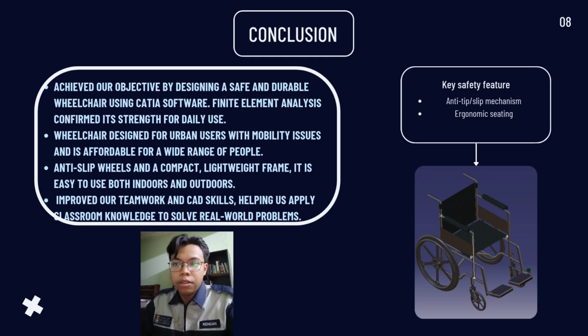So I will talk more on the conclusion of our project and also the overview of all of our drawings and the parts themselves, the assembly. So in conclusion, we have successfully achieved our objective by designing a safe and durable wheelchair using the CATIA software as per the course requirement.